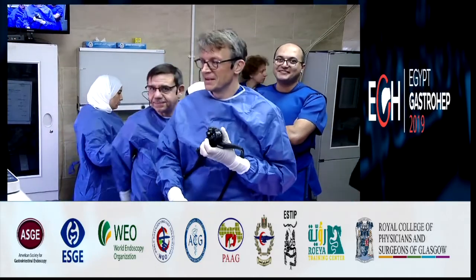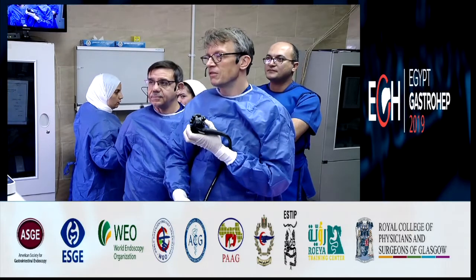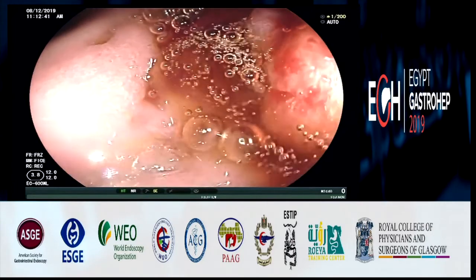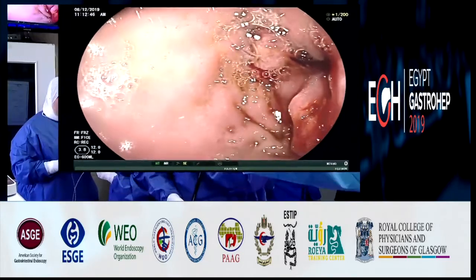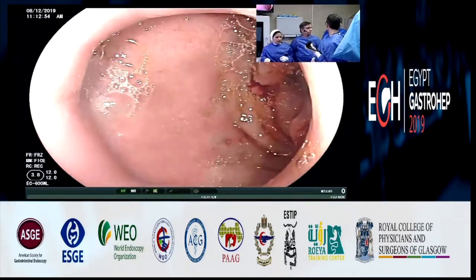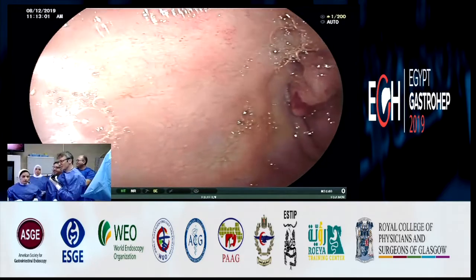Hello everyone. Welcome back for this second day of live endoscopy. So it's my pleasure to introduce this case, with the whole team here, with our anesthesiologist, Mektab. Also we have Selma and her colleague, and Hania, the nurses team, and of course I'm working under the close supervision of the Egyptian doctor, Dr. Khaled. And as you see on my right hand, our friend Professor Giovannini.